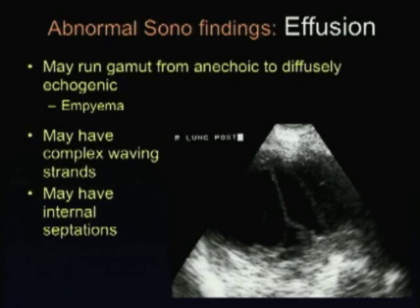Effusions may have a complex appearance. Initially with empyemas, clouds of layering white cells can be seen, and oftentimes as these effusions organize and reorganize, they may develop septations and strands, as can be seen in this case here, many times which wave around with respiratory movement, like pieces of seaweed in the pleural effusion.